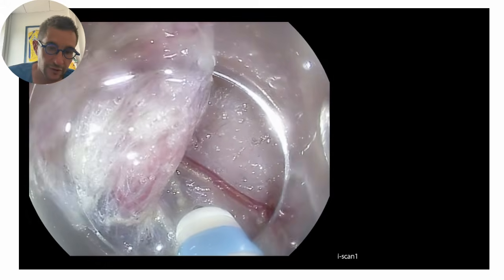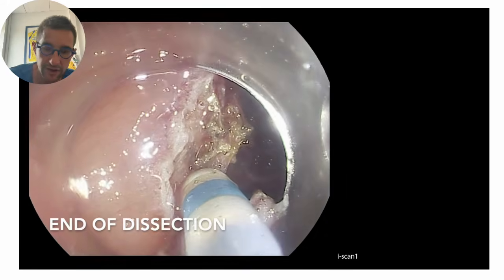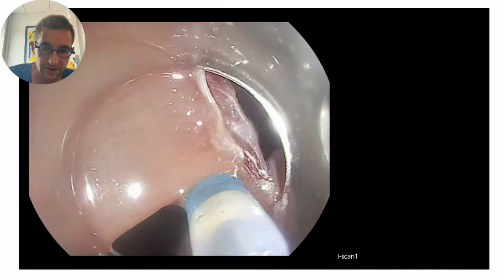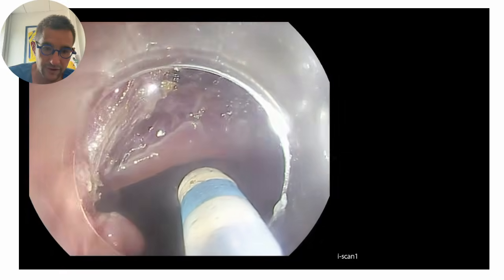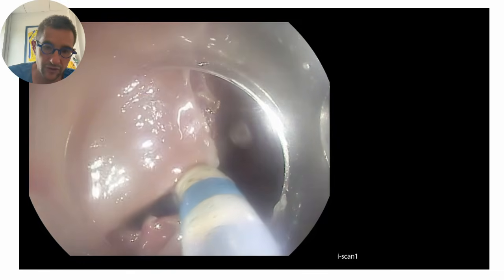And finally, the exposure is very good until the end of the lesion without anything going into the field of view. And we could achieve this resection completely with R0 resection, despite the fact that the scarring process was quite strong.